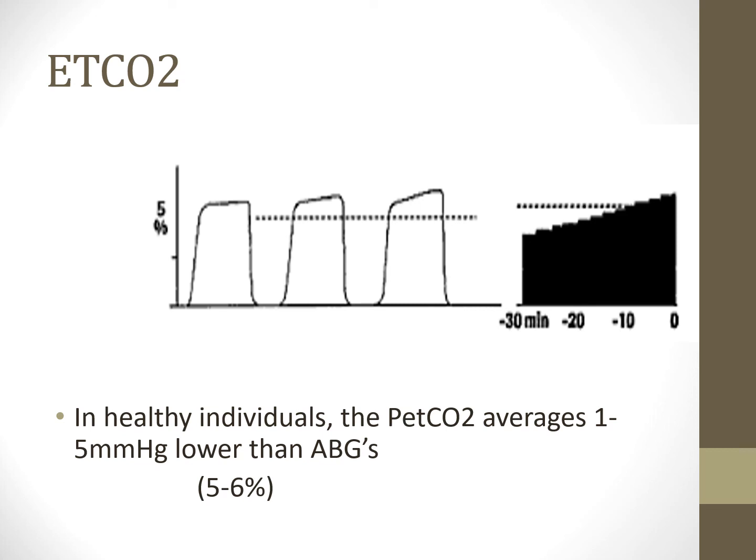But when we draw a blood gas, their PaCO2 is actually going to be high. So the further discrepancy you see between end-tidal and arterial CO2, the more dead space you have. That means you created either alveolar dead space with something like hyperinflation, or anatomic dead space has been created, right? So that can be a sign of alveolar destruction, airway destruction, burn victims, things like that.